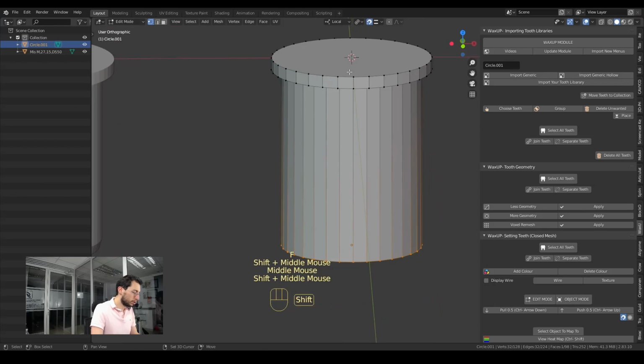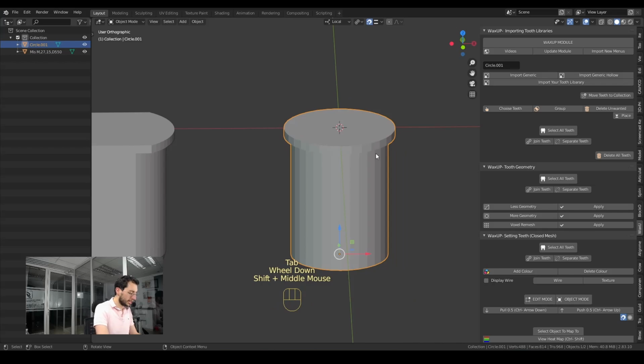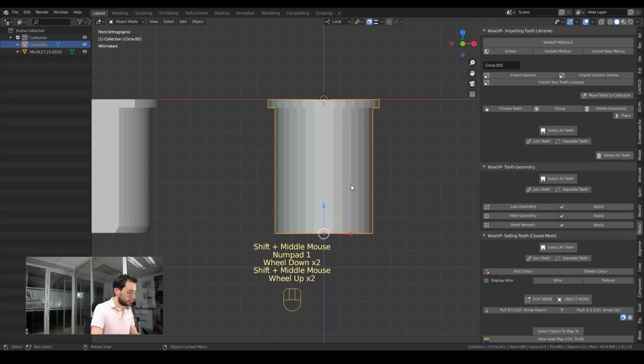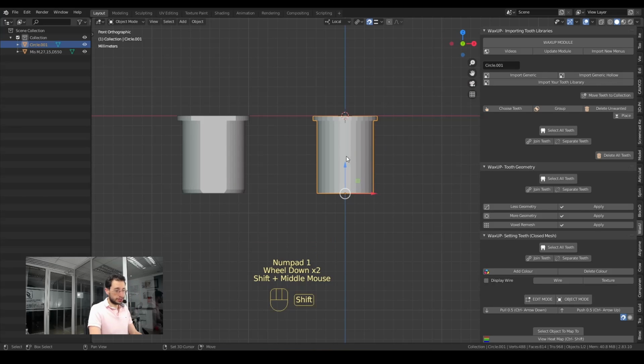It's not always recommended to close something with this, which is an N-gon, a polygon with too many vertices. But in this case, I think we are going to be just fine. Anyway, that's my metal sleeves, that easy.